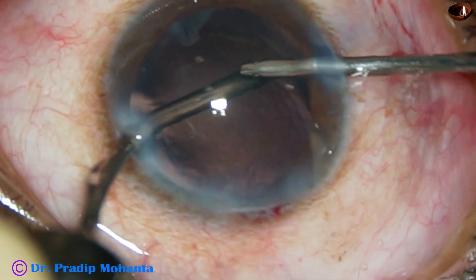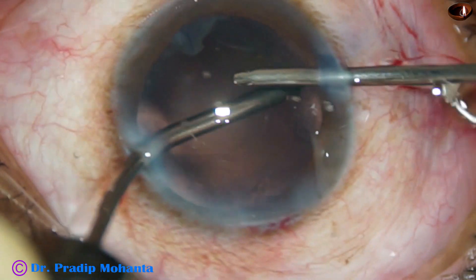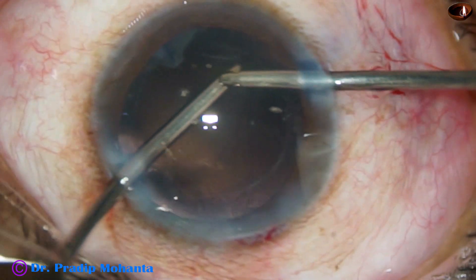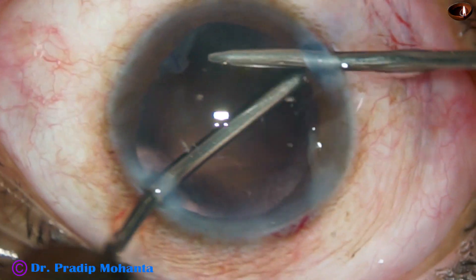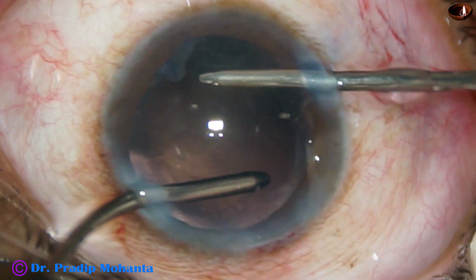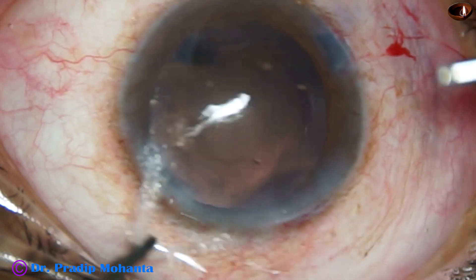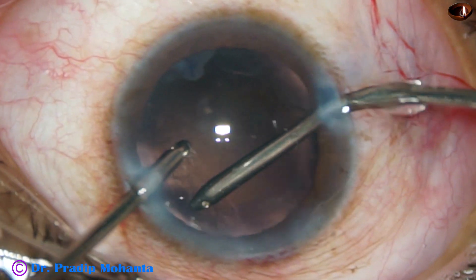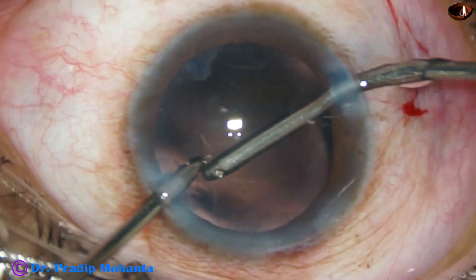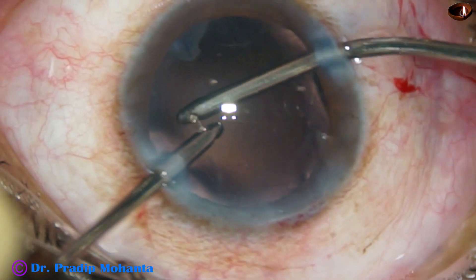So this was a very challenging case, particularly the rhexis part. Sometimes we may have to use vitreous scissors in cases where the fibrous sheet goes up to the equator. In such cases you have to use a Vannas scissor or vitreous scissor, make an opening, and then do phaco or SICS.